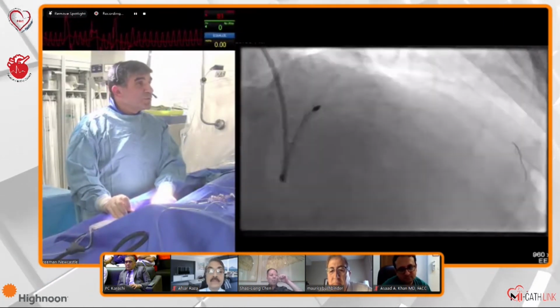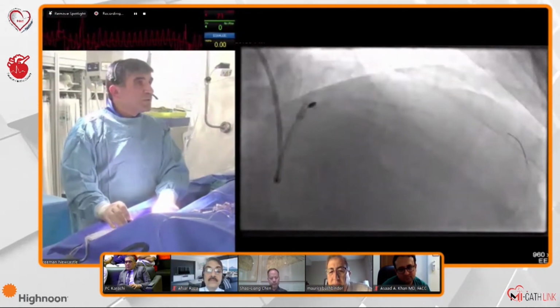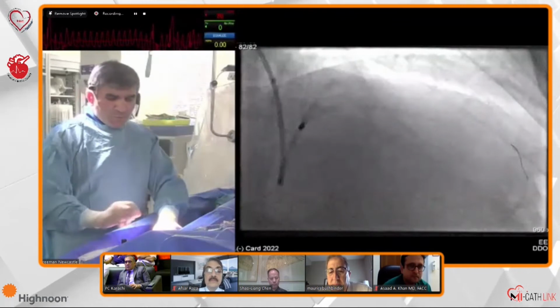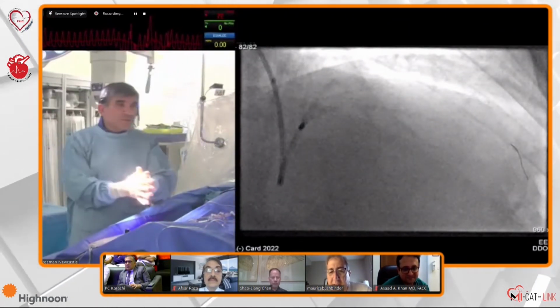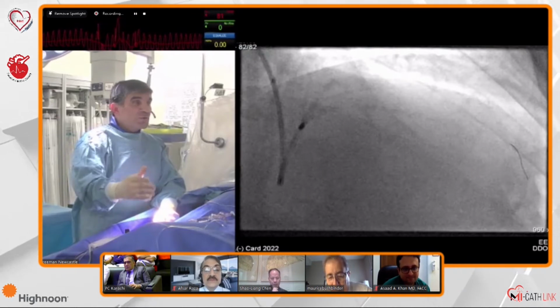And it's quite good. So take your time. Absolutely. I think this is the thing. Patience with rotablation is really paramount. And I see people doing this, and I don't understand where that technique comes from, but it's just incorrect. To do this is not right. You get the burr to the lesion, let it work 2-3 seconds and come back.